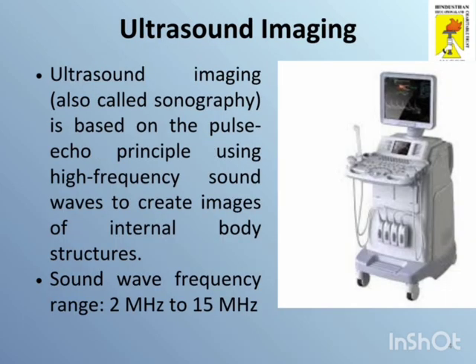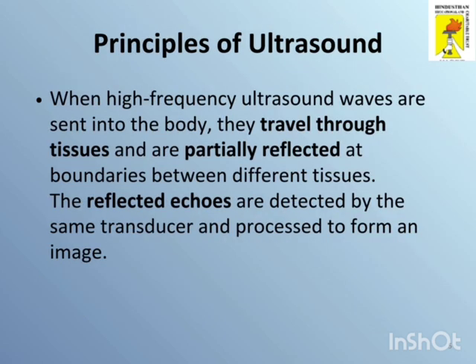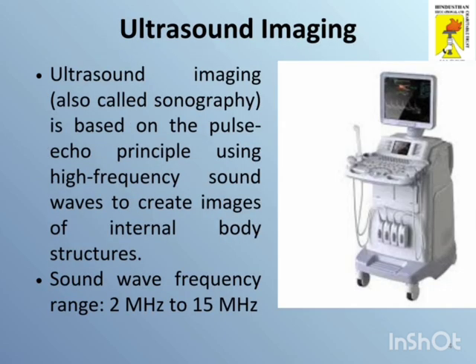In the context of biomedical engineering, let us understand what ultrasound is. Ultrasound imaging is also called sonography. It is based on the pulse echo principle, using high frequency sound waves to create images of the internal body structures. Ultrasound helps in visualizing the internal body structures using high frequency waves. The sound wave frequency ranges from 2 MHz to 15 MHz.